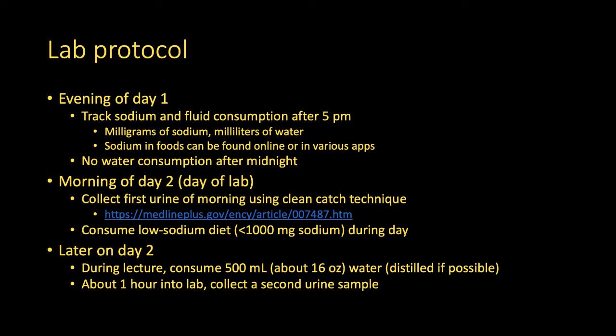When you come to lecture, during the lecture, consume at least 500 milliliters of water. That's 16 ounces, but feel free to consume more. That should be purified or distilled water if possible. And then about an hour into the lab period, you're going to collect a second urine sample using the clean catch technique. And then you'll analyze both of those samples using a dip strip and probably also a urinometer.